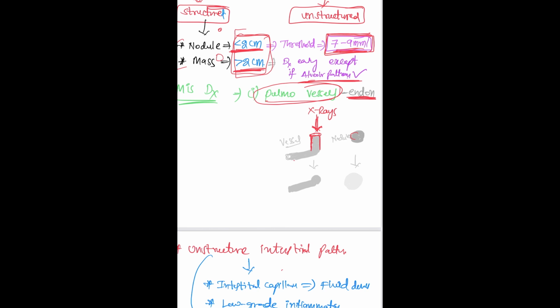So irrespective of the depth, it will appear as a teeny small nodule-like structure here, because the X-ray is just giving the shadow of the structure on the film. This portion, since it has side on projection, will appear normally as an outline.